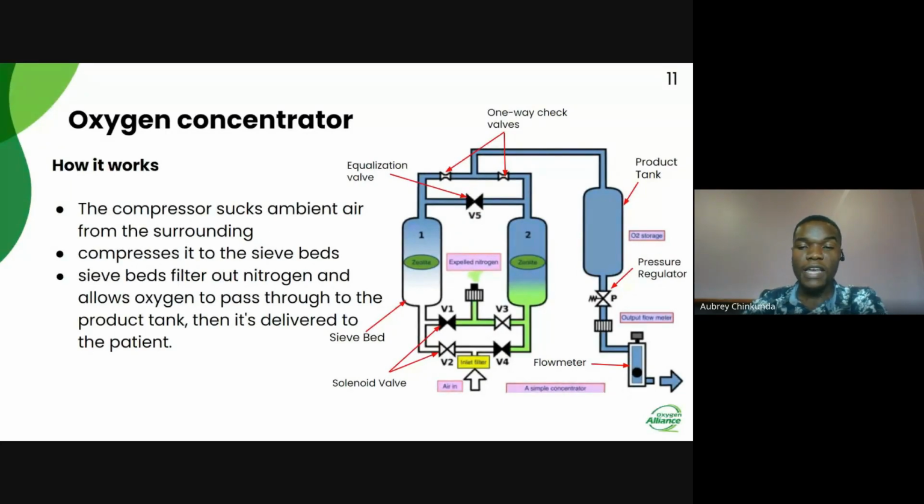The Oxygen Alliance has a lot of resources concerning oxygen concentrators. So this was just a brief explanation. There are a lot of resources on the website, the Oxygen Alliance website, and the YouTube channel as well. So you can go visit the website to get more insight on how various oxygen concentrators work. But basically, it just produces oxygen. It's an oxygen source. So that's about the oxygen concentrator.